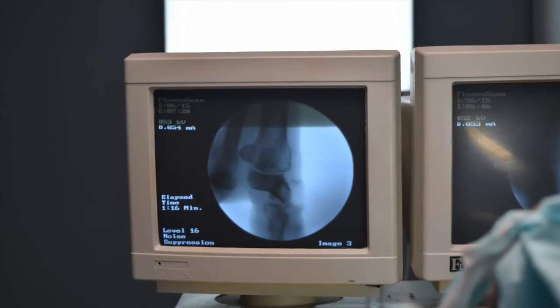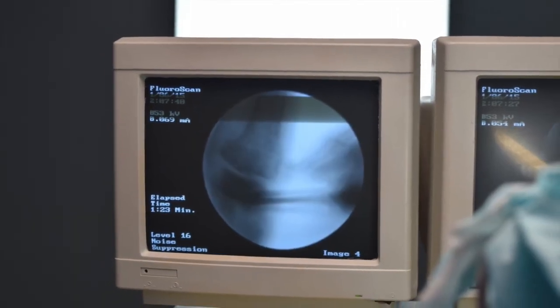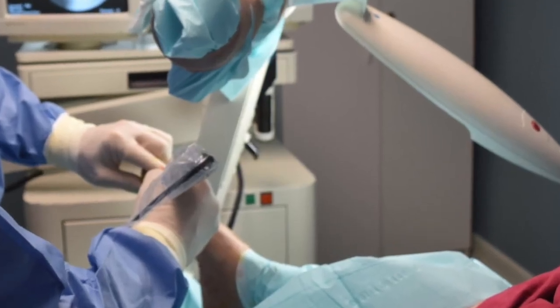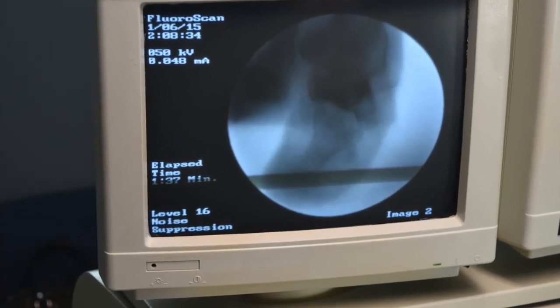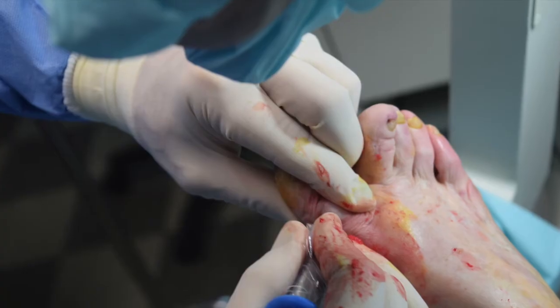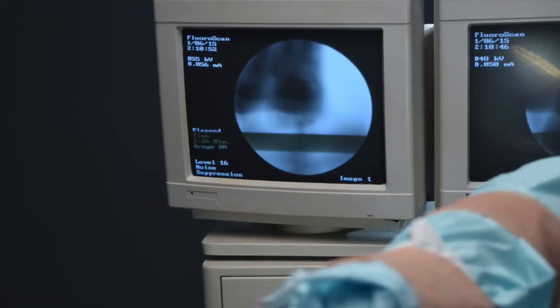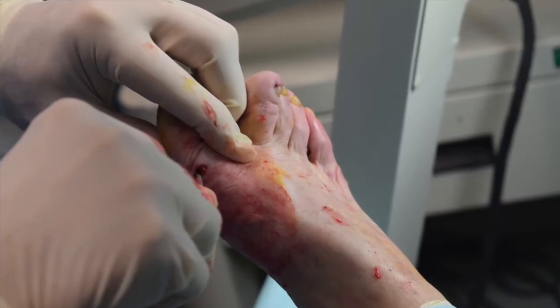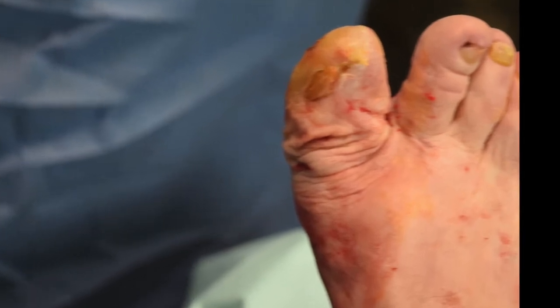Here is a closer view of the same plane. When we felt like we had adequate removal of infected bone and a good cut, we went on to get our wedge performed a little better to wedge the toe upward. You can see where we're getting some more of the bone infection out. Of course we left this open so that it would drain out. At this point we had most of our infection under control prior to the surgical procedure. We took a rasp and cleaned out any remaining bone.